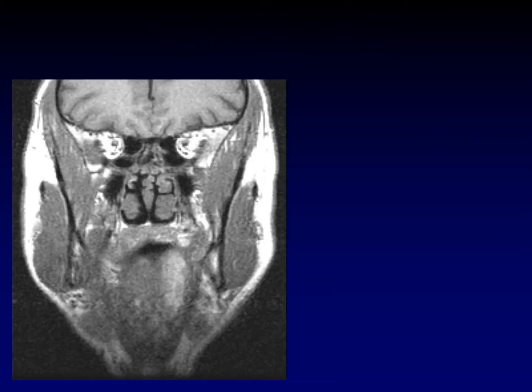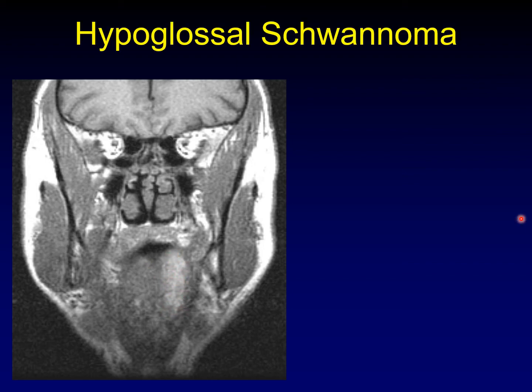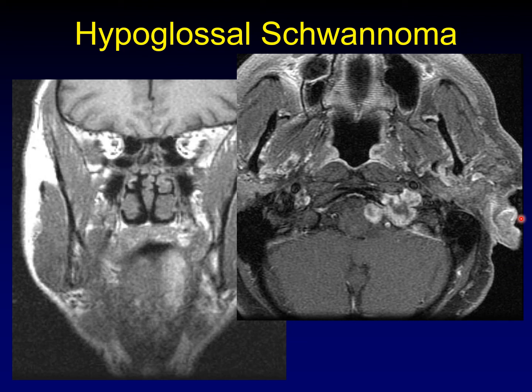Here is another example on coronal T1 without contrast. The bright signal on one side of the tongue represents fat — fatty replacement of the hemi-tongue — while the other side shows normal muscle. Turning attention to the hypoglossal canal, we see characteristic schwannoma enhancement in exactly the expected location: the hypoglossal nerve running obliquely through the lateral medullary cistern and then through the hypoglossal canal — a hypoglossal schwannoma in this case.